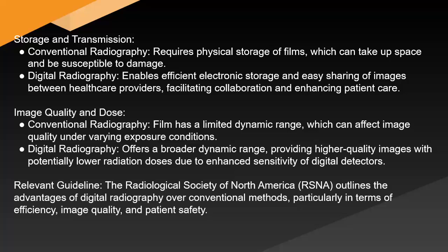Digital radiography enables efficient electronic storage and easy sharing of images between healthcare providers, facilitating collaboration and enhancing patient care. Image quality and dose: conventional radiography film has a limited dynamic range, which can affect image quality under varying exposure conditions. Digital radiography offers a broader dynamic range, providing higher quality images with potentially lower radiation doses due to enhanced sensitivity of digital detectors. Relevant guideline: the Radiological Society of North America (RSNA) outlines the advantages of digital radiography over conventional methods, particularly in terms of efficiency, image quality, and patient safety.